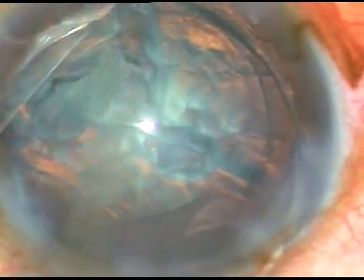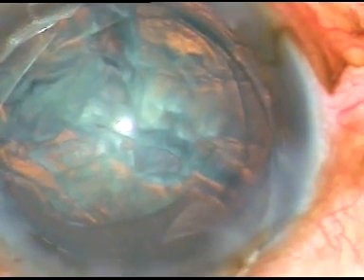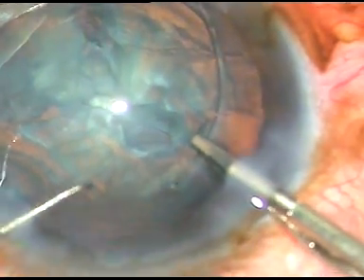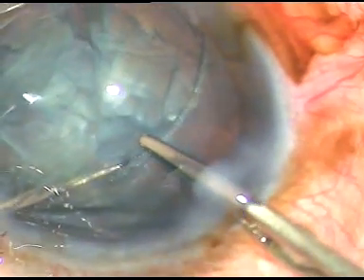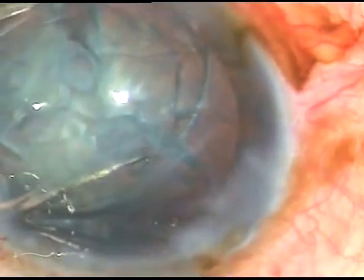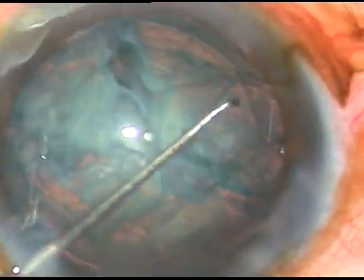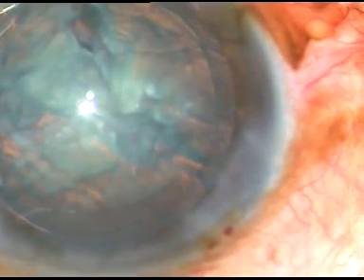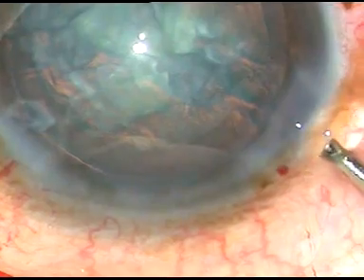I take a Sinskey hook in my left hand, I take McPherson's in my right hand, go inside, I introduce the Sinskey hook, the prong goes into the eye. Now I transfer the CTR to the Sinskey hook, and the Sinskey hook guides the CTR beautifully to the equatorial region of the bag. That's it. The CTR has been nicely placed.